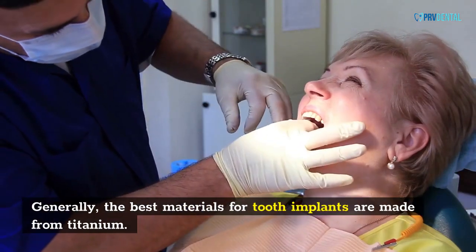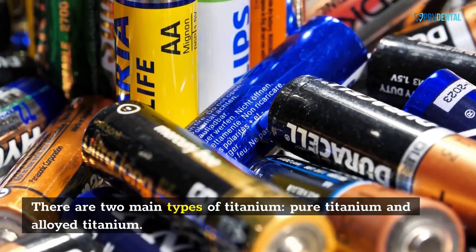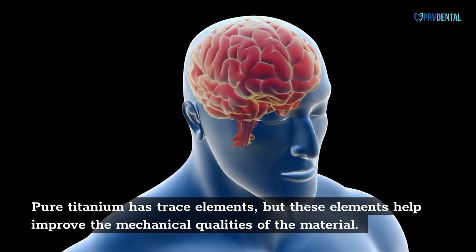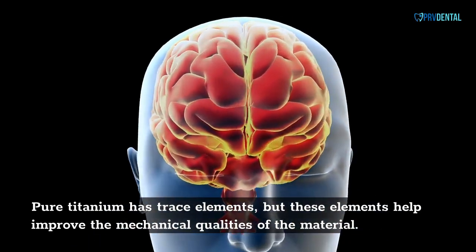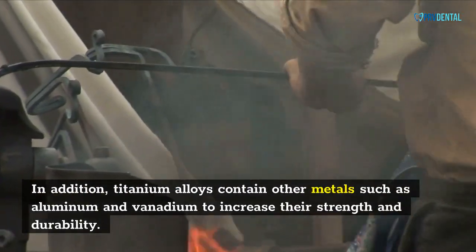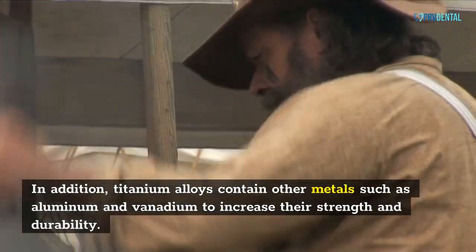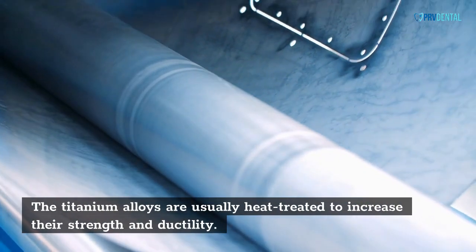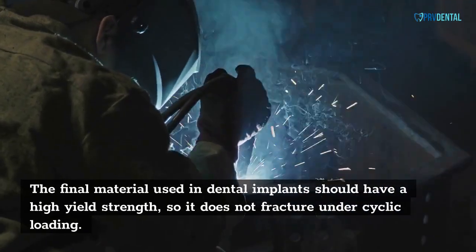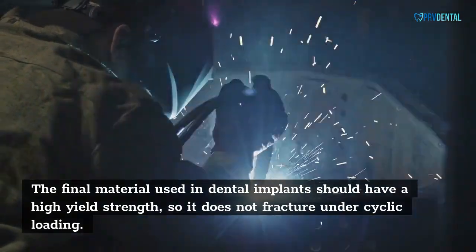Generally, the best materials for tooth implants are made from titanium. There are two main types of titanium: pure titanium and alloyed titanium. Pure titanium has trace elements, but these elements help improve the mechanical qualities of the material. Titanium alloys contain other metals such as aluminum and vanadium to increase their strength and durability. The titanium alloys are usually heat-treated to increase their strength and ductility. The final material should have a high-yield strength so it does not fracture under cyclic loading.